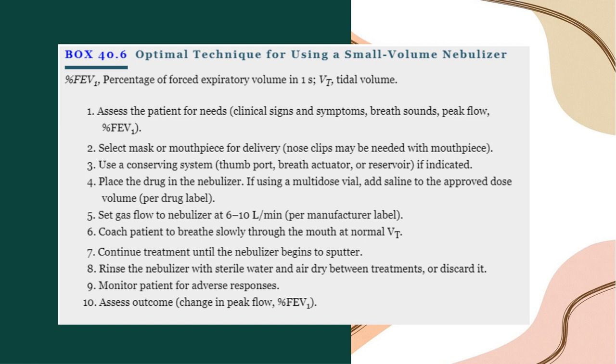We'll explore the different types of nebulizers, their mechanisms, and how they impact drug delivery efficiency. It's important to understand that the choice of nebulizer can influence medication deposition, treatment time, and patient comfort. This overview helps us appreciate the technological advances that improve patient outcomes and optimize therapy. By connecting these points, we see how understanding both the principles of aerosolization and the nuances of nebulizer devices enhances our ability to tailor treatments to individual patient needs, ultimately supporting better respiratory health management.